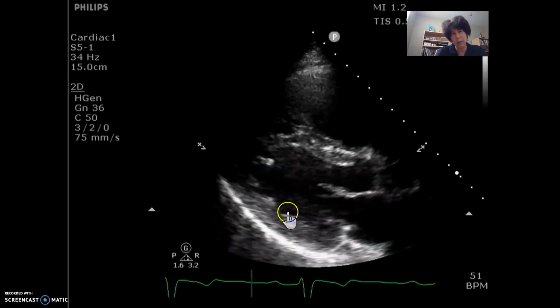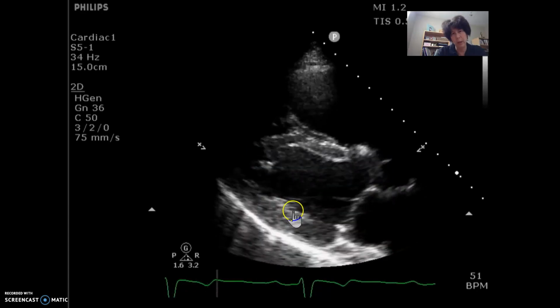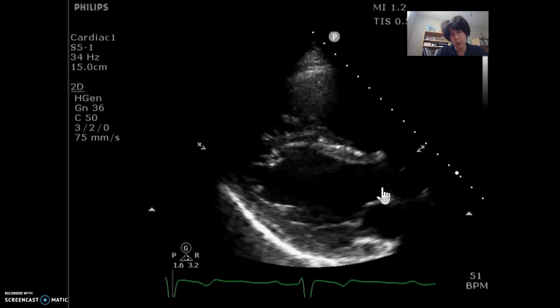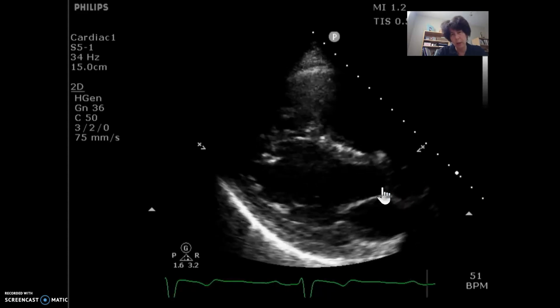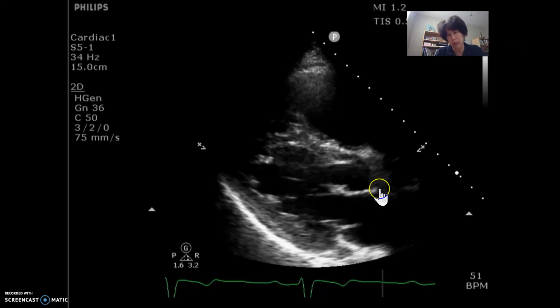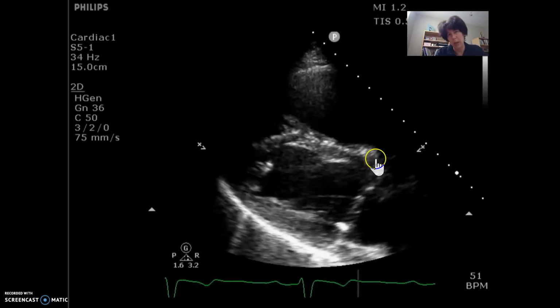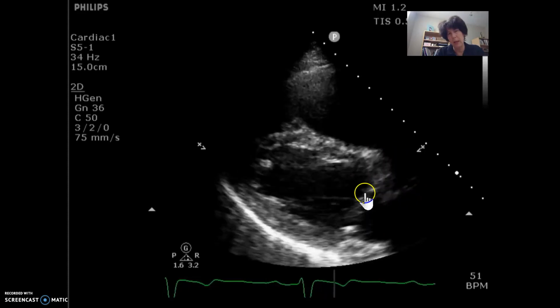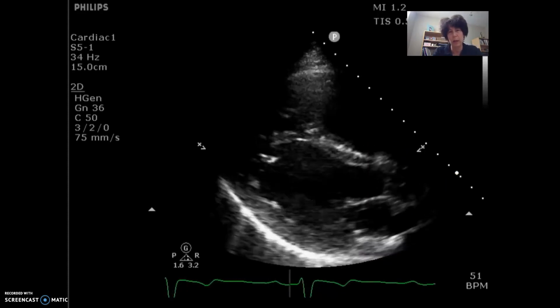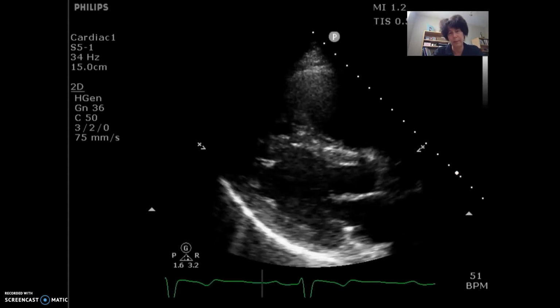And to be fair, this whole ventricle looks a tiny little bit hypokinetic in this view. The aortic leaflets are not 100% clear, but you do get the impression that there's some opening and that the leaflets are not thickened, and we don't get that sense of calcified echo dropout that you would get with a very calcified aortic stenosis, so likely a normal aortic valve there.